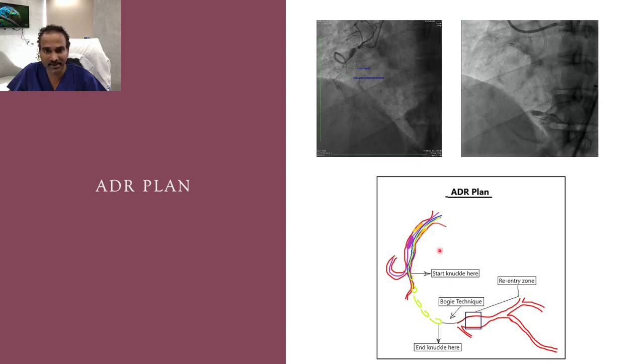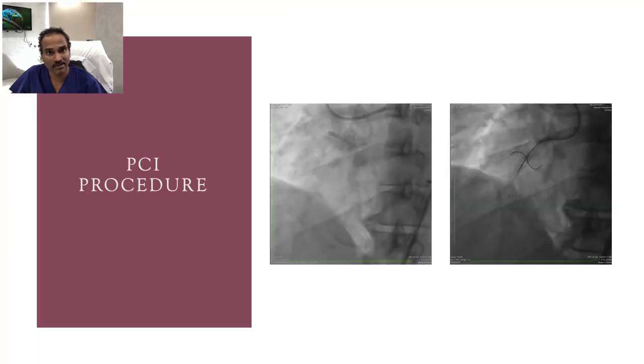Re-entry is with Stingray. And coming to the support for ADR, we planned to take an Amplatz antegrade guide with balloon trapping of the microcatheter for adequate support for the knuckle wire. So yeah, this is the ADR plan.